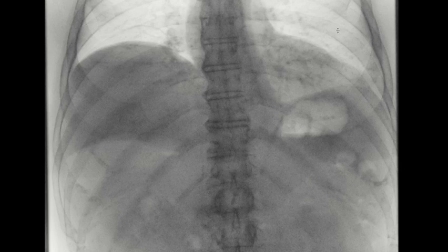We decrease intrathoracic pressure and bring air into the lungs. When we exhale, the hemidiaphragms rise and they push air out of the lungs. Pay attention to the difference between the right hemidiaphragm and the left hemidiaphragm.